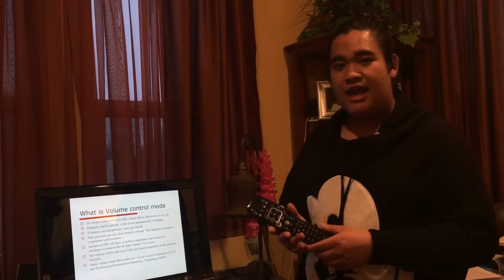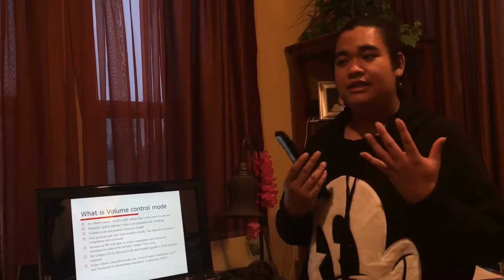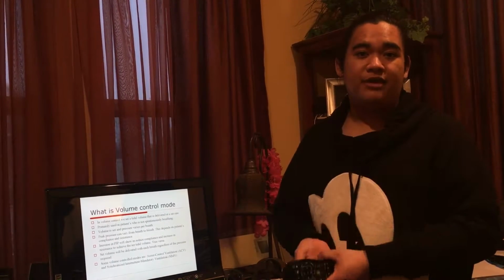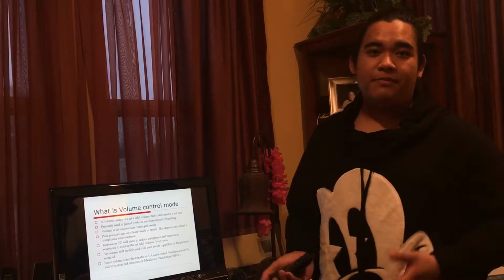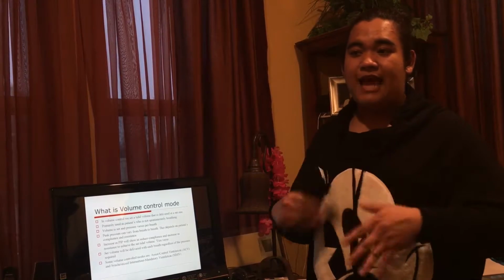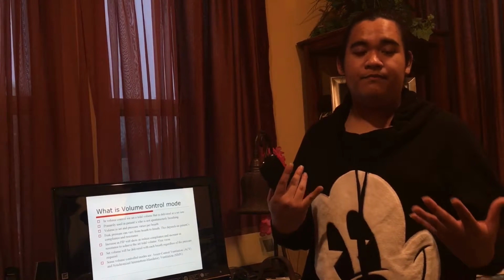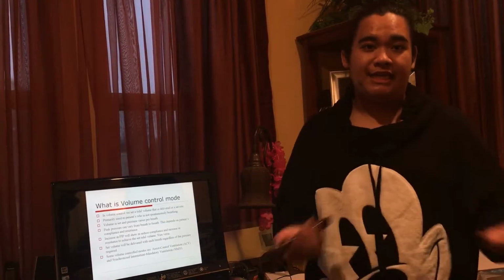So in every breath that the patient takes, at 20 breaths per minute, the patient will get 225 mLs per breath. If we think of it, that's kind of good for the patient, because with every breath the patient is getting a good volume that the patient's body will need.